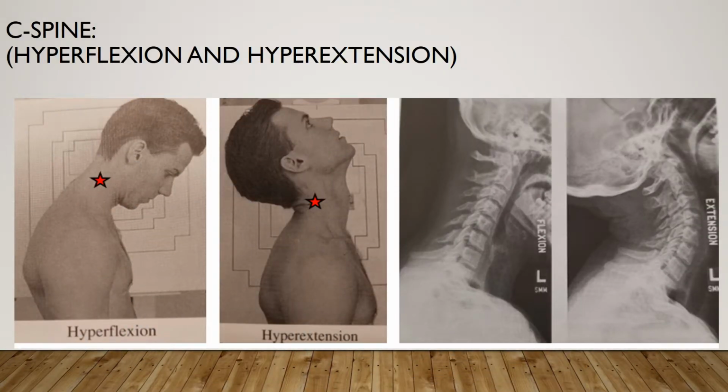Here are two images of the cervical spine with hyperflexion and hyperextension. You want to have an SID of 60 to 72. 72 is preferable. Patient is standing or sitting. Erect is preferred. You want to place the patient in a true lateral. The C-spine is aligned to the CR. You want to relax and depress the shoulders as much as possible.